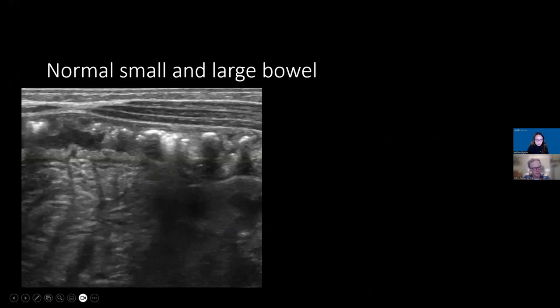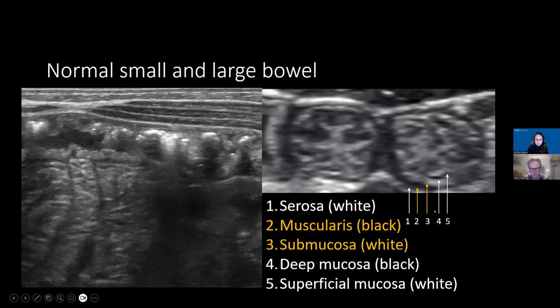Normal colon shows a little air, soil, and gas. Bowel wall shouldn't be too thickened. Normal small bowel when collapsed looks pretty monotonous. You should be able to see all five layers, but the two layers reliably visible are the muscularis — the thicker black line — and the submucosa, the brighter line. You should always be able to see at least three layers to maintain the gut signature.